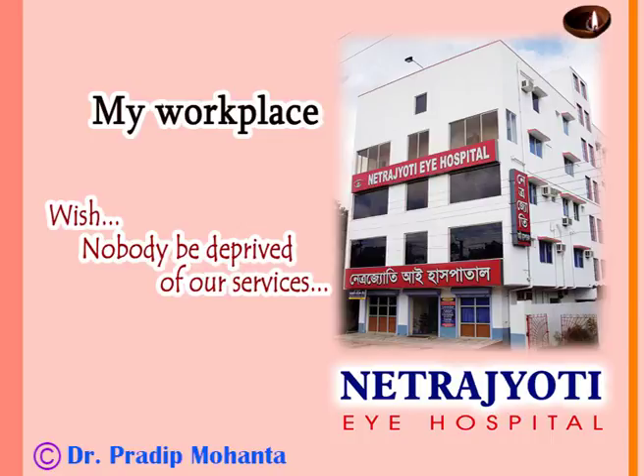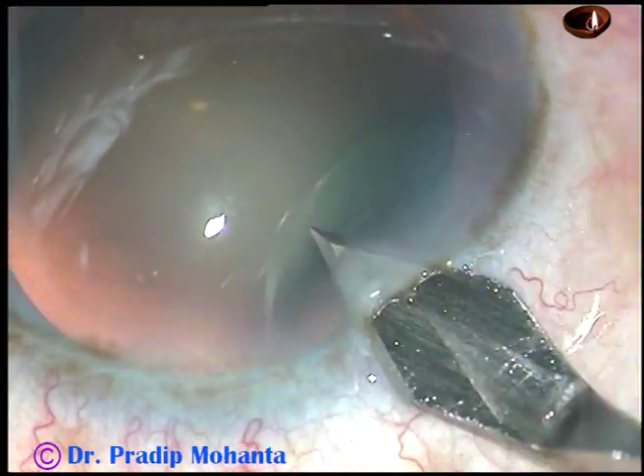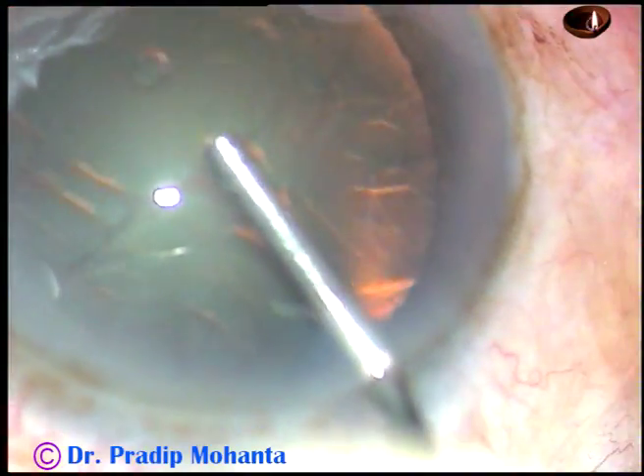Friends, this is a totally unedited phacosurgery. Let us observe the surgical steps. This is the main incision at the posterior aspect of the limbus. We can see that this is a cataract with grade 2 plus or grade 3 nuclear sclerosis.